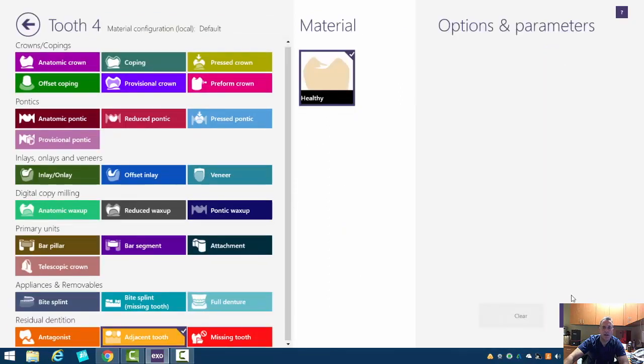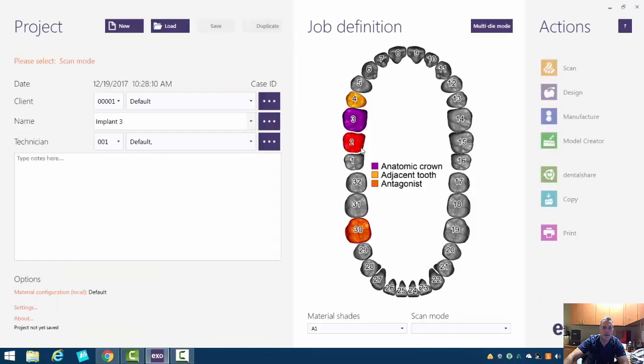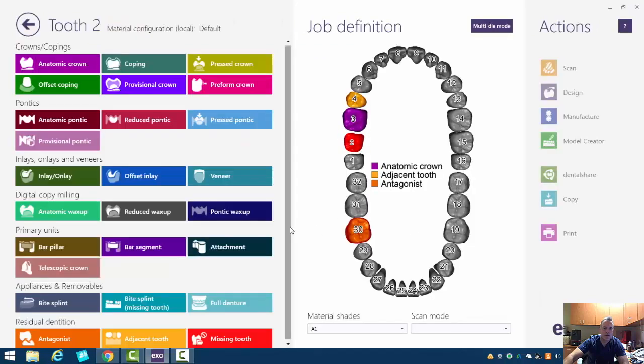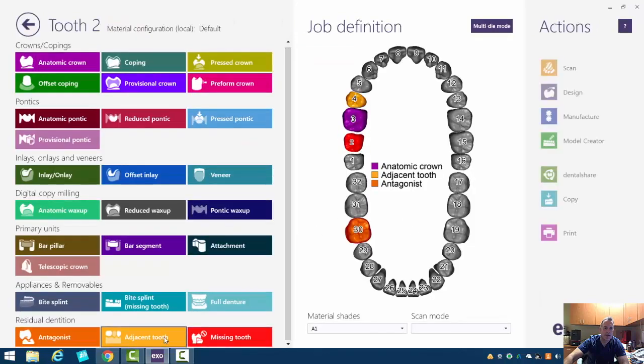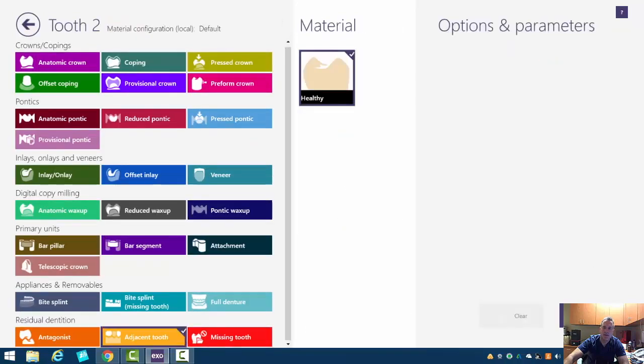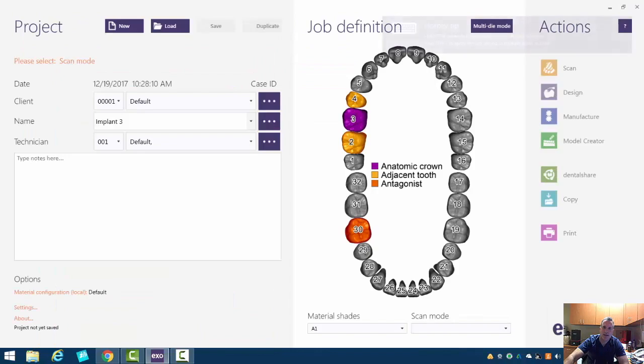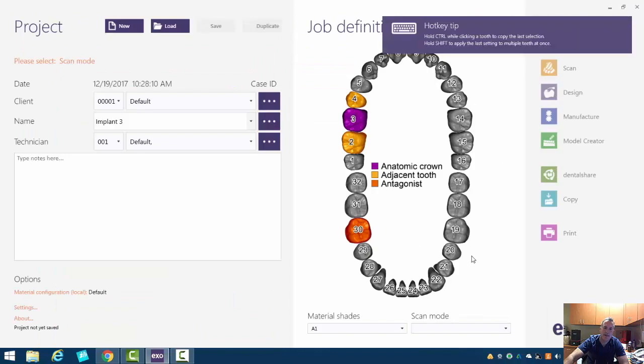So we'll click on number four adjacent tooth, number two adjacent tooth. And again, if you're used to systems like CEREC, it does all this stuff for you.